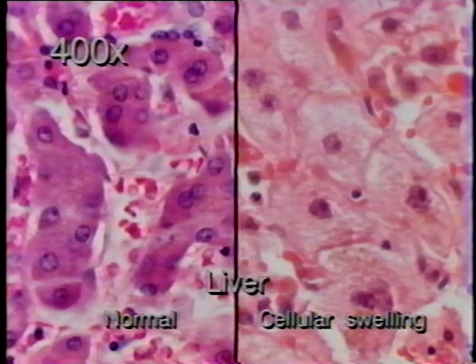Higher magnification of the same tissue may make the changes more obvious to you. The cell at the end of the pointer shows no signs of irreversible damage. Had this cell remained in vivo, it would have had the potential to recover normal function. Other nearby cells exhibit changes which indicate that they were irreversibly damaged and are now dead. These features will be discussed when cell death is considered.